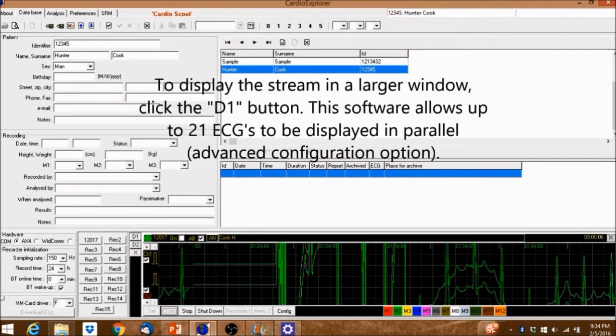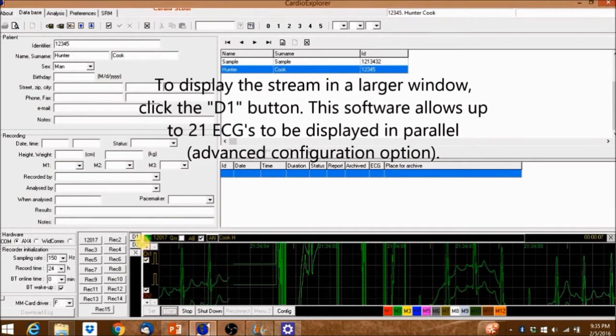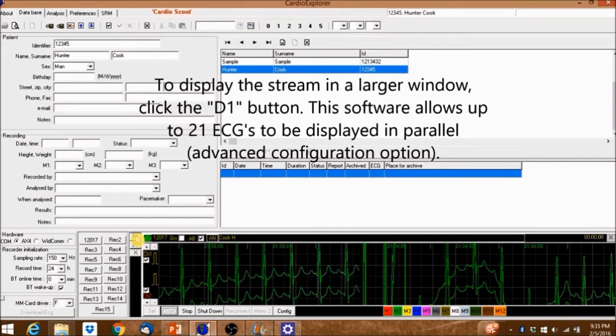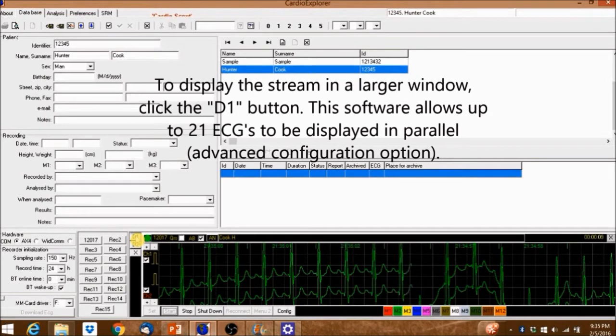To display the stream in a larger window, click the D1 button. This software allows up to 21 ECGs to be displayed in parallel with an advanced configuration option.